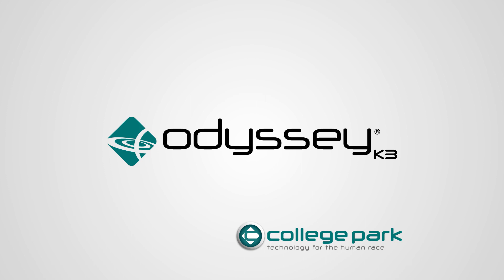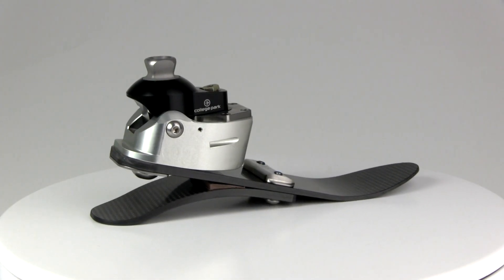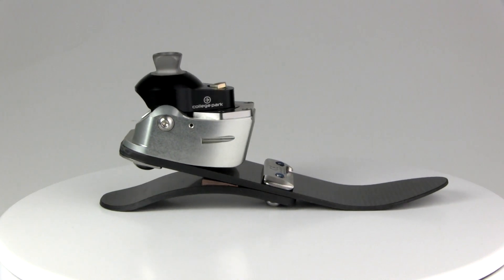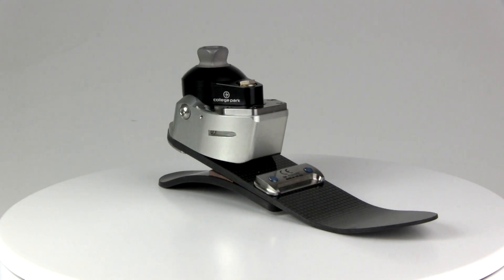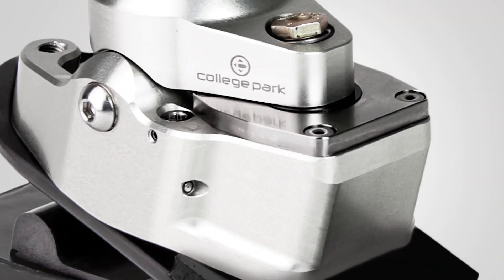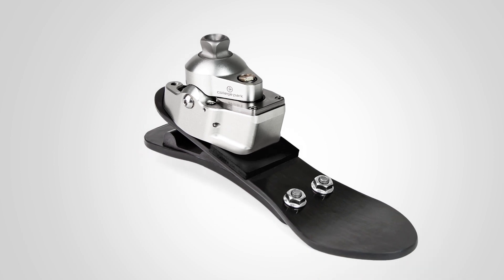The College Park Odyssey K3 foot is the next step in our hydraulic evolution, with a patented curved hydraulic cylinder, dynamic composite foot base, and dual stride control plus unrivaled height and weight. Our first hydraulic foot, the Odyssey K2, brought extraordinary patient outcomes. Following that success, we're bringing the same ingenuity to the K3 market.